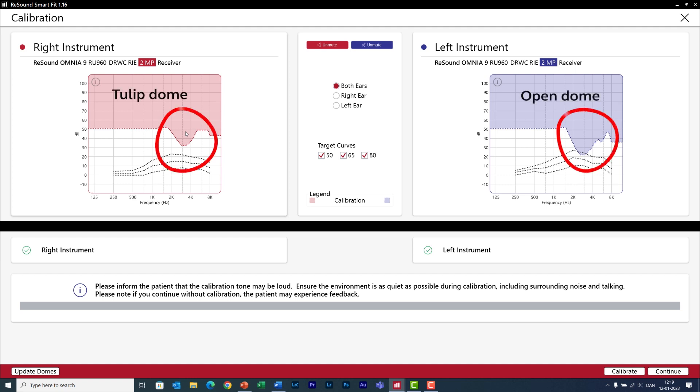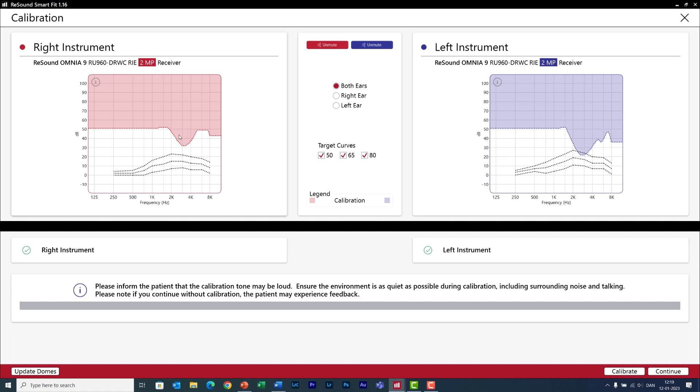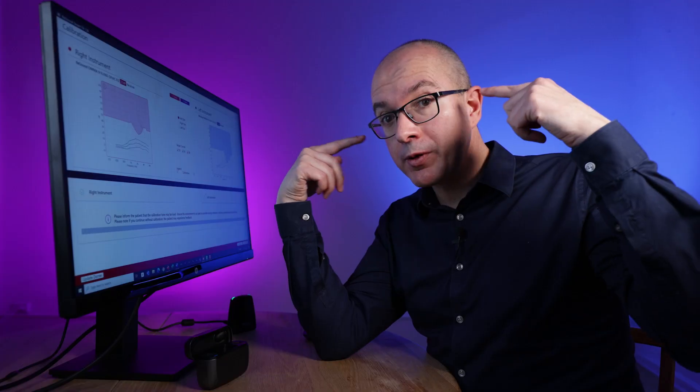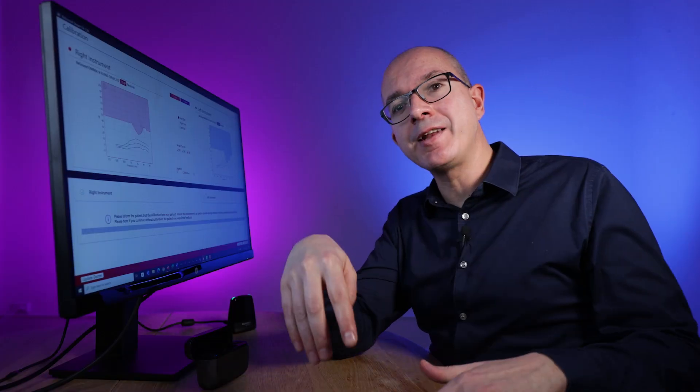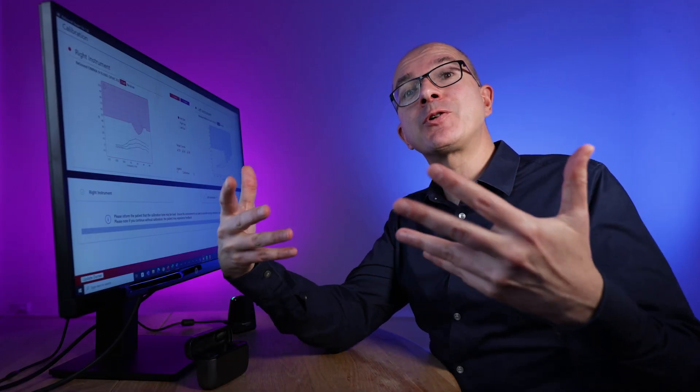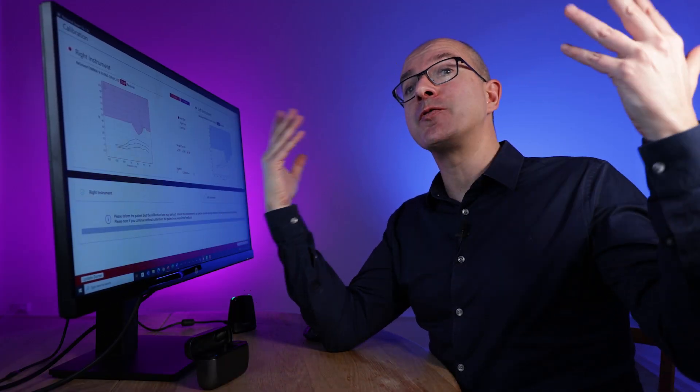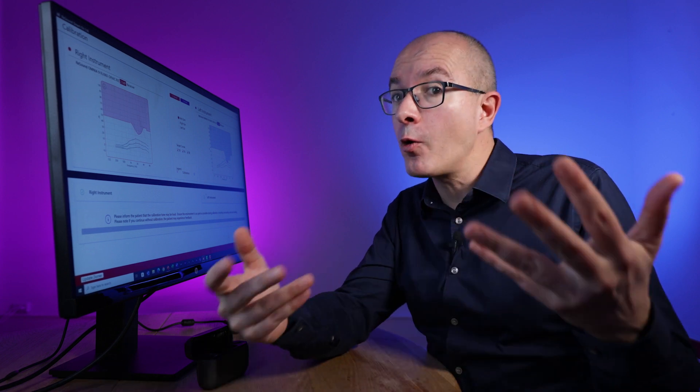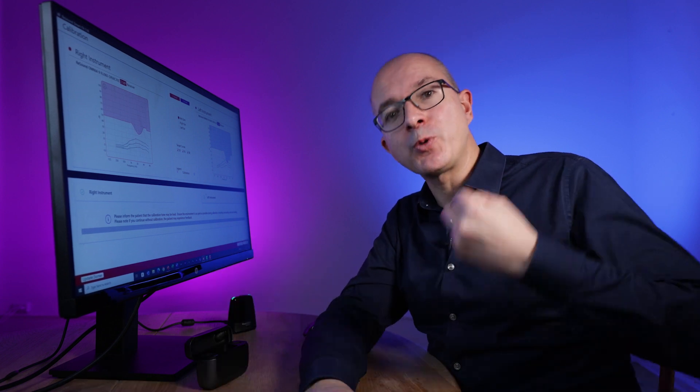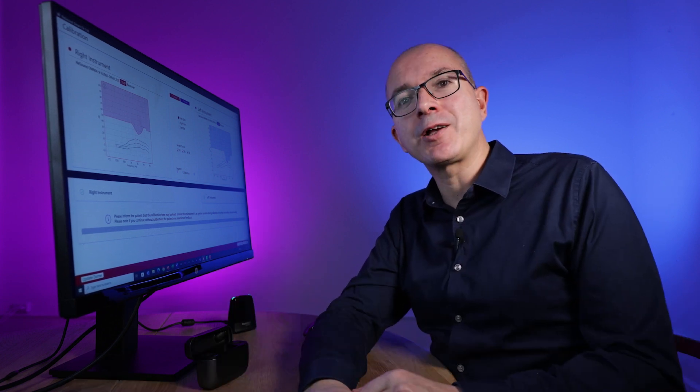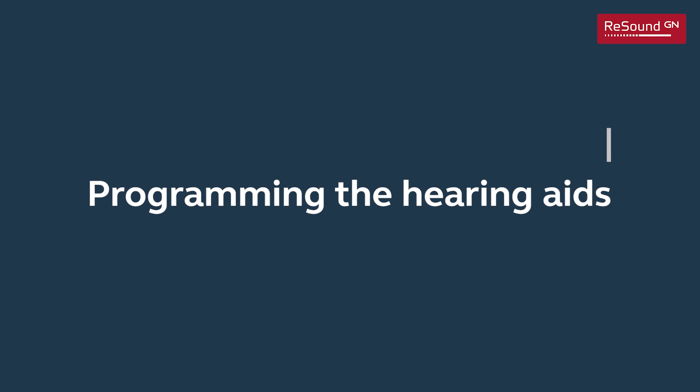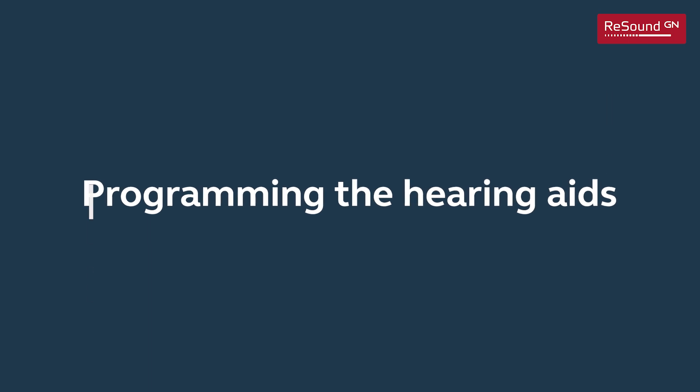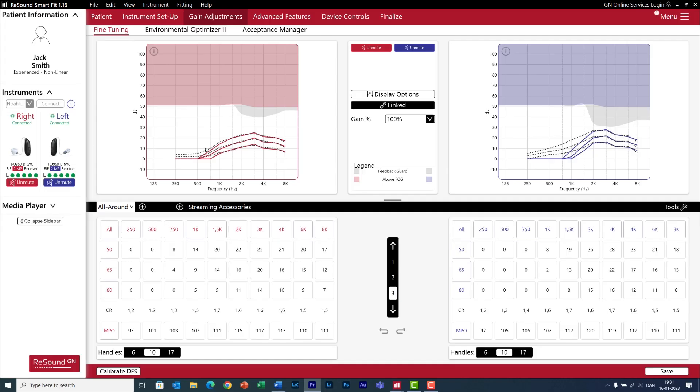This is the risk of feedback area and note the difference between the domes. Both domes feel very open and comfortable but the tulip dome closes the ear canal a bit more and therefore reduces the risk of feedback area. So now we are ready to activate the hearing aids. Let your client hear for the first time with the new hearing aids and hopefully get those emotional reactions that we all love. Welcome to the main screen of the fitting software.